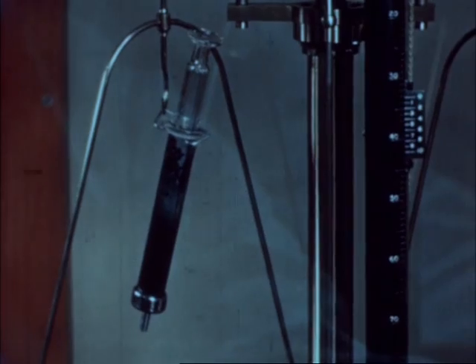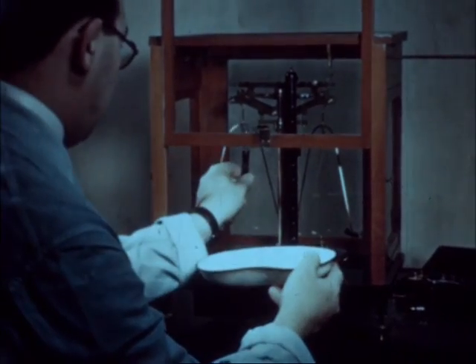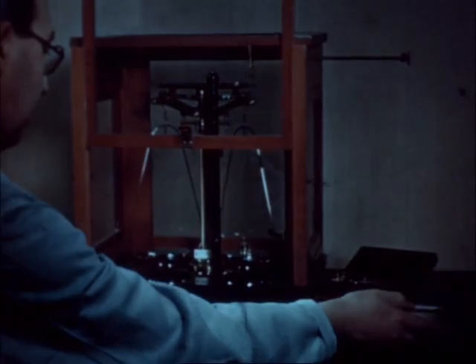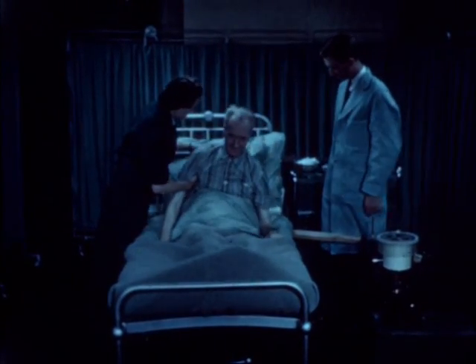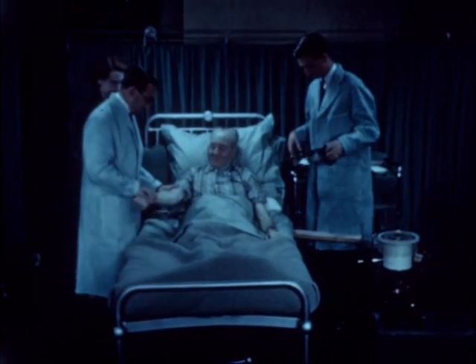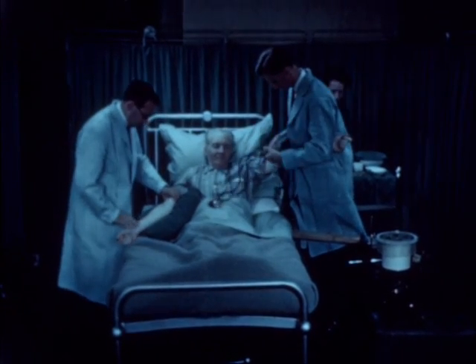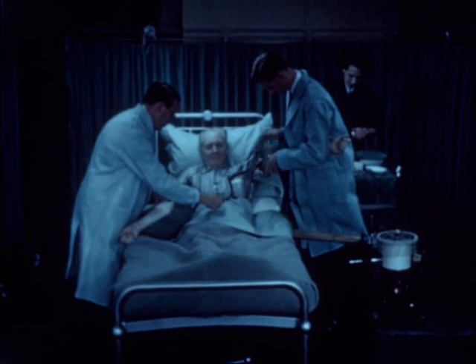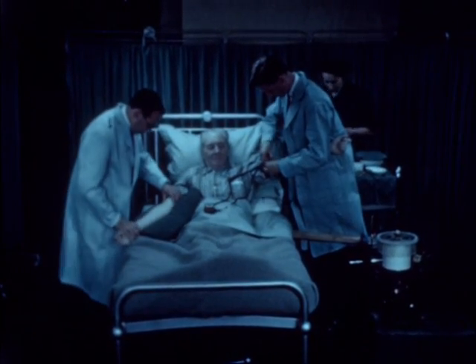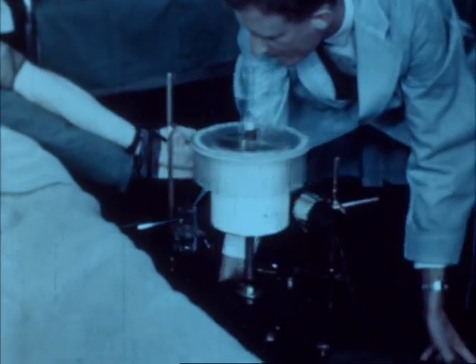In practice, this method is applied in the following manner. The amount of injected dye is carefully measured by weighing the syringe before and after the injection. Meantime, the patient is made comfortable and his right arm is placed on a pillow. His sphygmomanometer cuff is wound round his left arm. The position of the left arm is then fixed by strapping to a board passing under the mattress.